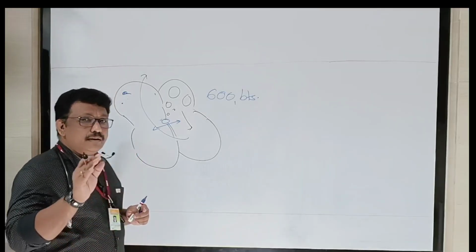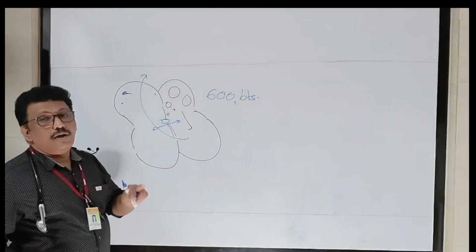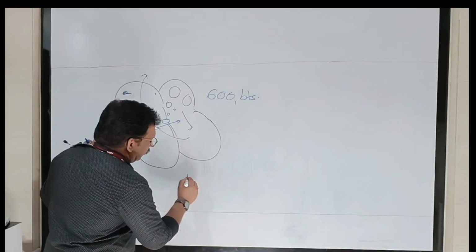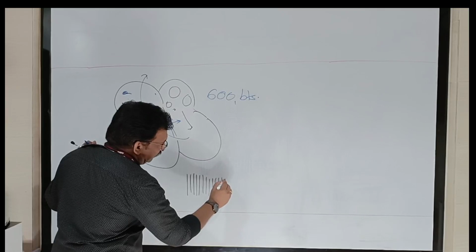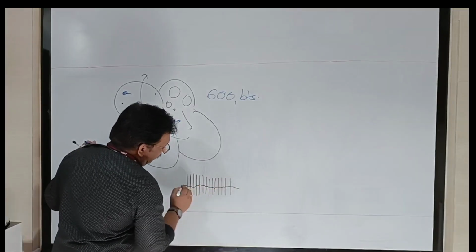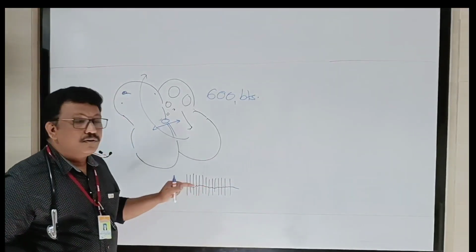So whatever it is, we'll control the rate and we'll avoid the blood coagulation problem here. Atrial fibrillation means, as we already told, there is a large number of irregular QRS complexes, which means the heart rate is very high, and a wavy baseline of the ECG. Now our aim in the emergency room is to control the rate.